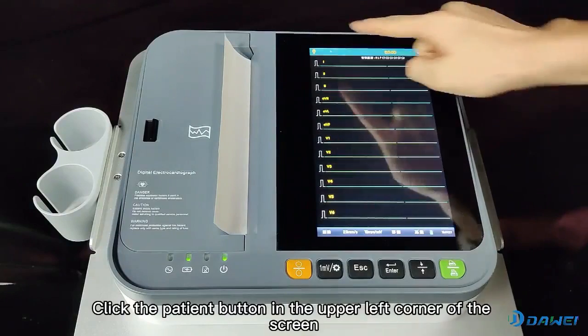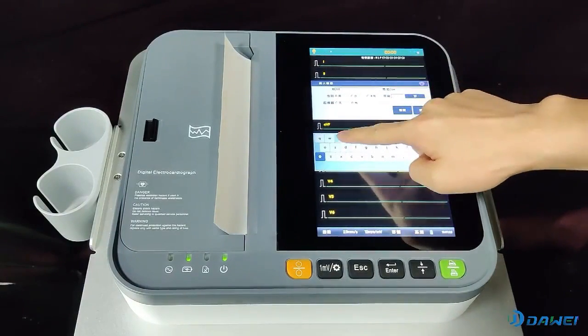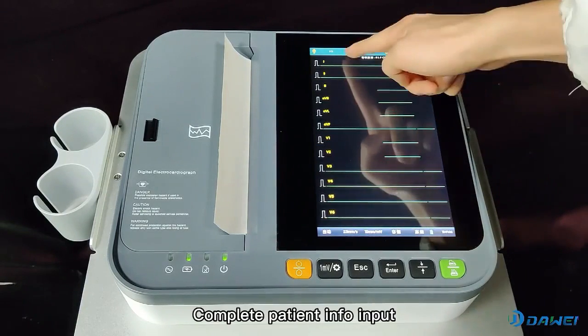For clinical use, click the patient button in the upper left corner of the screen. Input the patient ID, name, gender, whether the patient has a pacemaker, and age. Complete the patient info input.